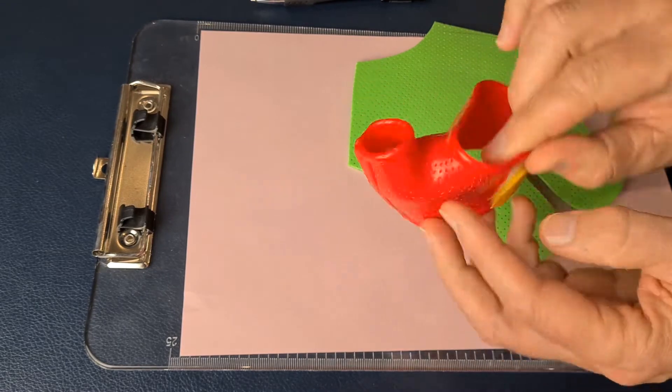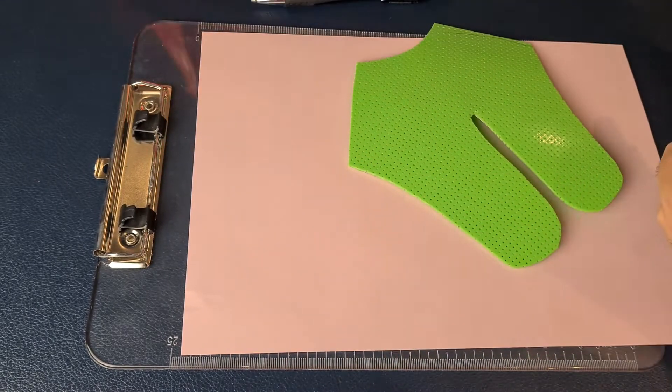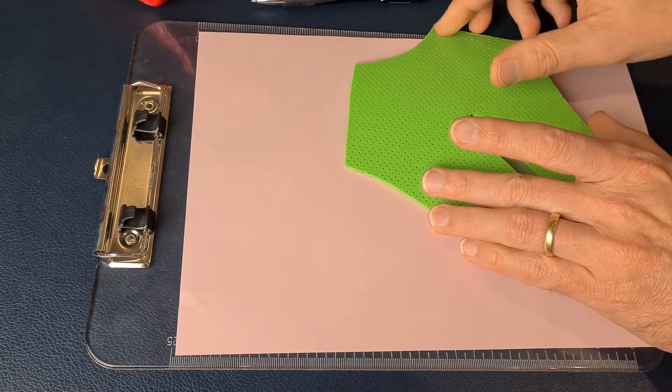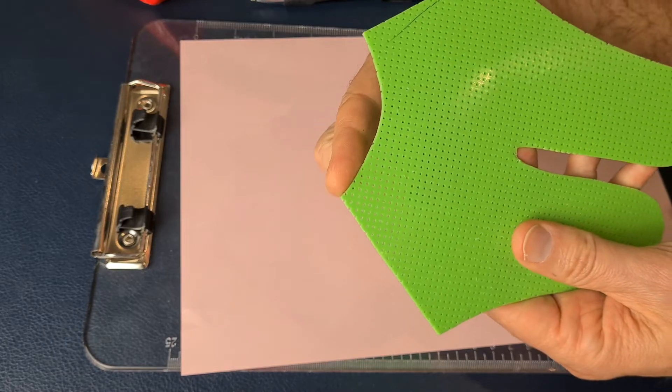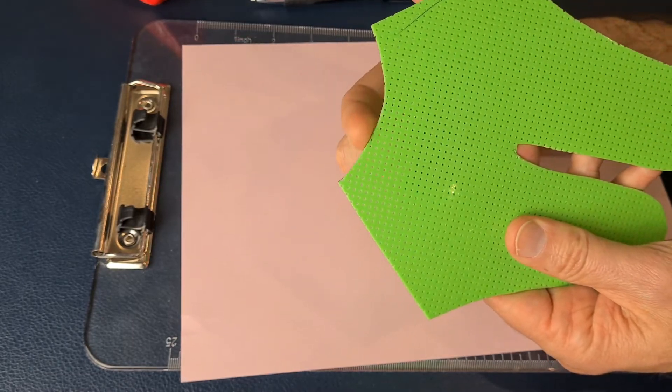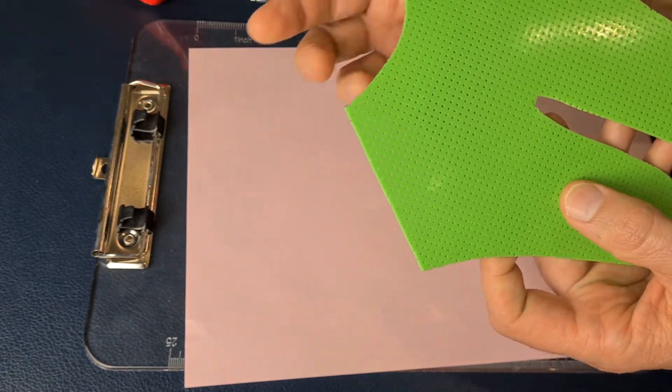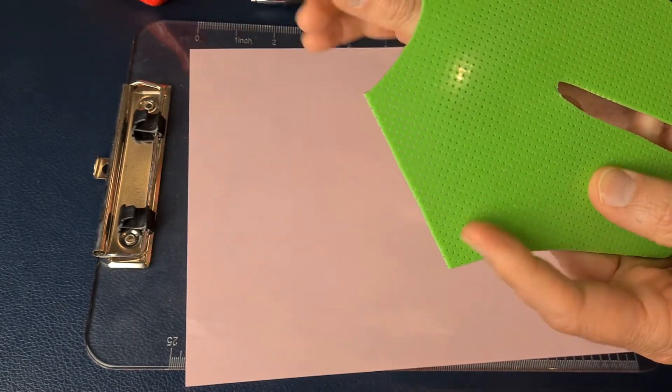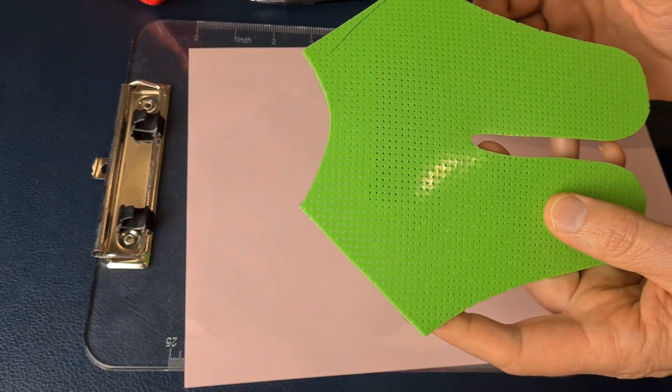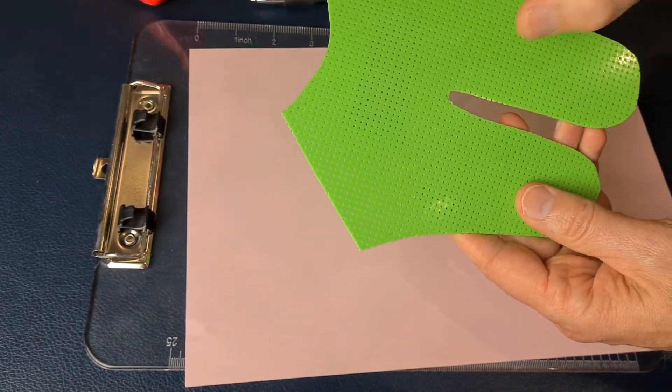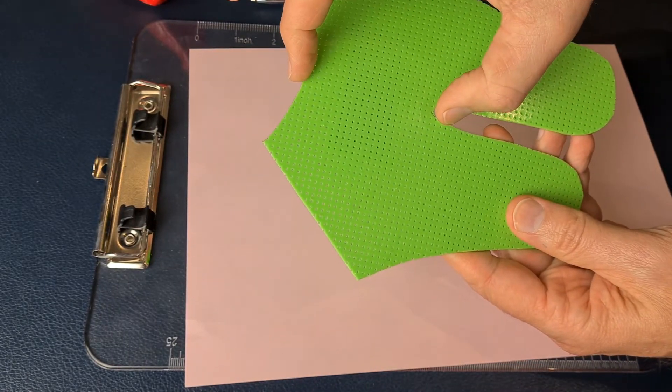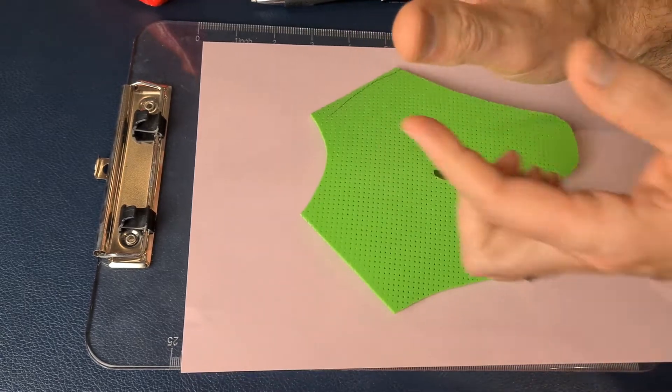So this edge here, the top edge, is going to be what wraps around the IP joint of the thumb. If you get a tape measure, you can measure the circumference around the IP joint.